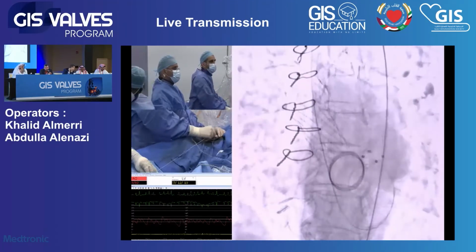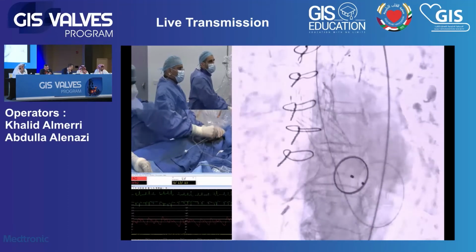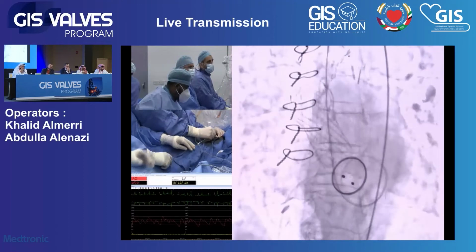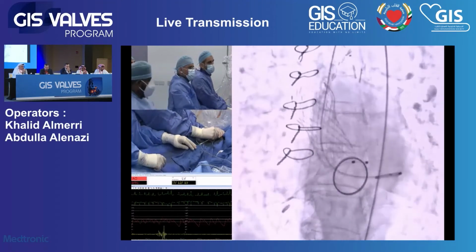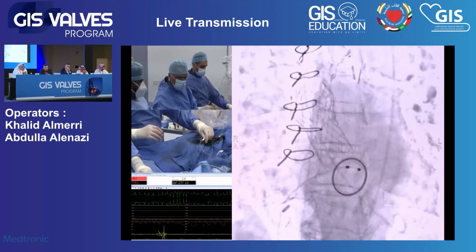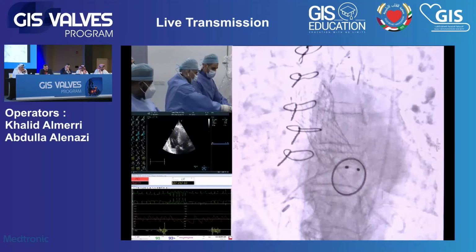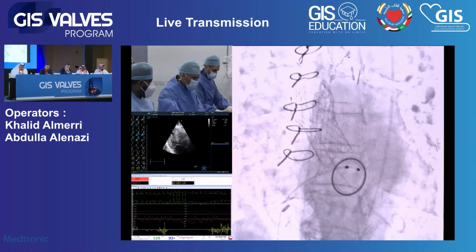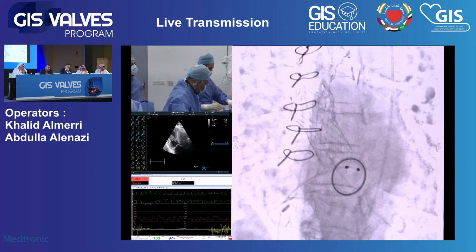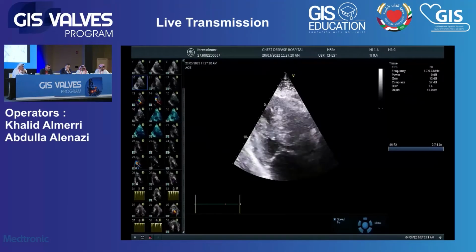So you will have an echo now, Dr. Khalid? You'll do an echo transfer? We will have an echo. We'll show you some hemodynamics here. Forward. Back, please. Yes. Okay. Good. We're going to zero both our lines to get accurate hemodynamics.